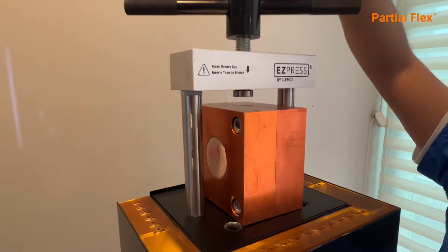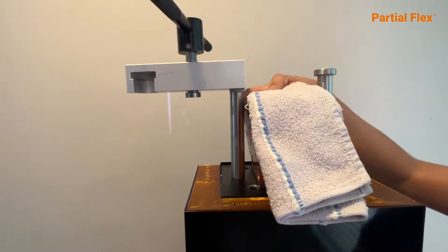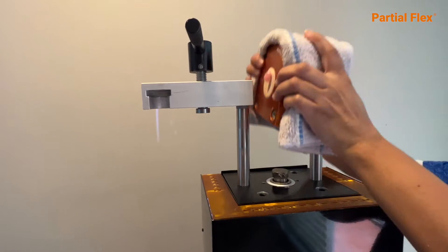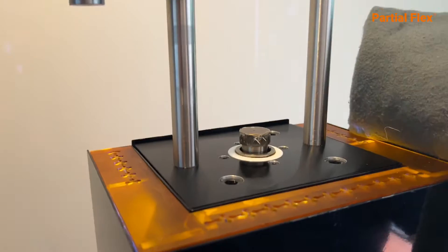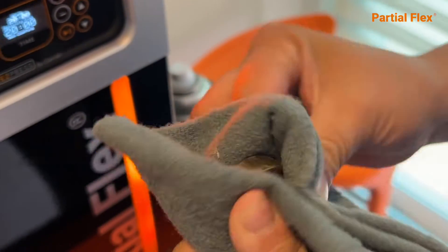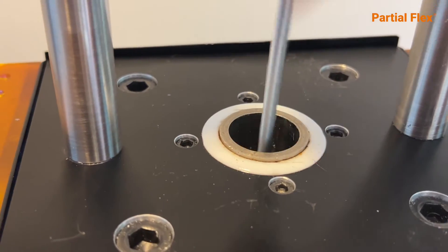Rotate to open and to free the flask, then press the injection button. Hold fast and have a cloth ready. Clean the injection stopper thoroughly. Clean the cylinder with a metal brush and wipe the piston completely clean.